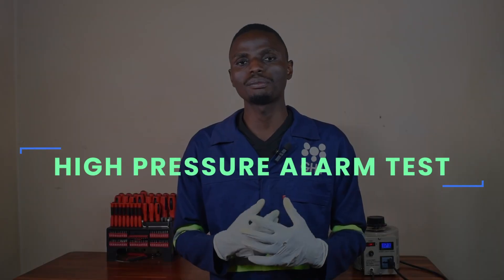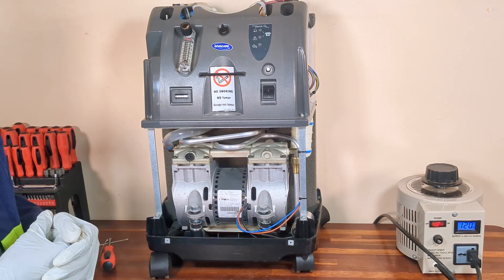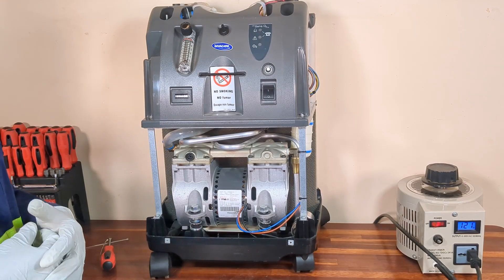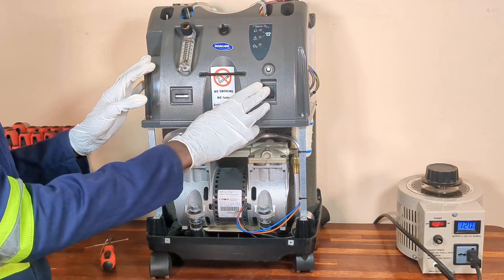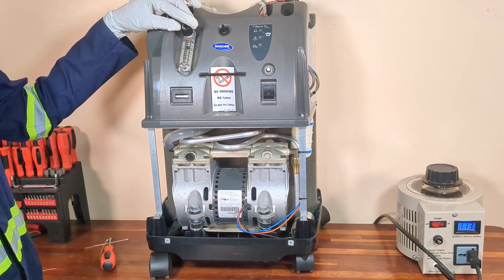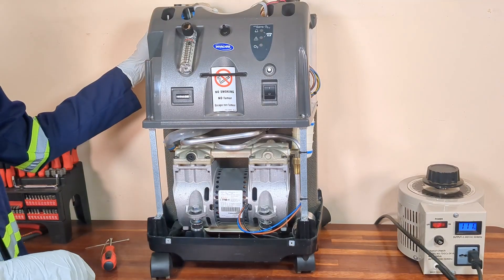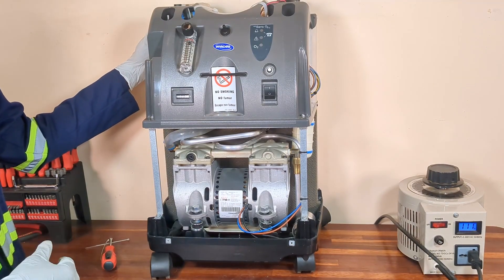Another test that we can perform is the high pressure alarm test. The high pressure alarm is designed to alert the user if the system is detecting rising pressure. For example, if the pressure in the product tank rises above 23 PSI — with a tolerance of plus or minus 1 PSI — the alarm should activate. To verify the functionality of the high pressure alarm, I will first turn on the unit and set the system flow to the maximum flow rate.